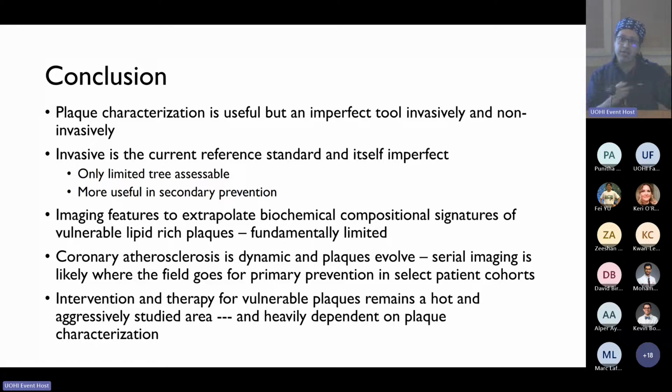Elucid is a company that's developed a thing that's not actually based entirely on the strength of the HU itself. They've actually put in some machine learning and based on histology. And that's quite interesting, because it seems that might be more accurate than what's just based on X-ray. So the software exists. You'll need to pay a license fee to use every one of these softwares. And every software has its own pros and cons. I didn't get into software in this talk because it'd just be too big.